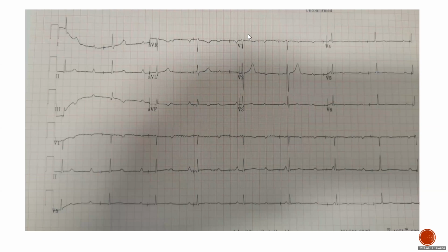Maybe sensing ventricle. Okay. Not sensing, not sensing. Okay. Yeah, it's not sensing. How do we know it's not sensing? Because the pacing spikes are the same interval.